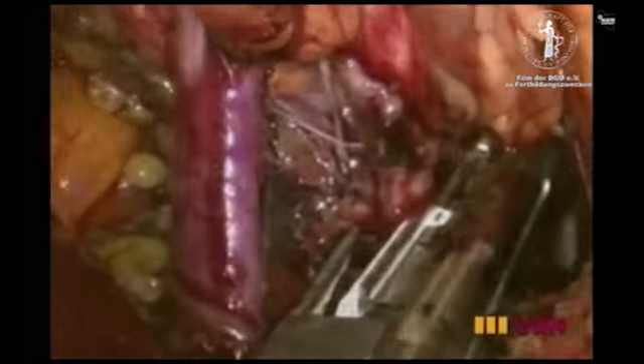The renal vessels are prepared and then dissected with vascular endoscopic staplers. In single-port radical nephrectomy, the kidney is removed along with Gerota's fascia, including the perirenal fat.